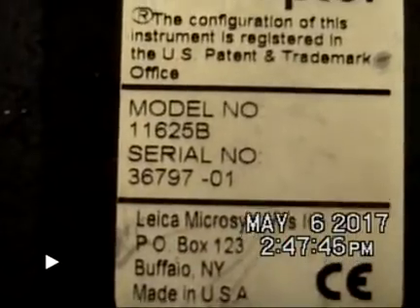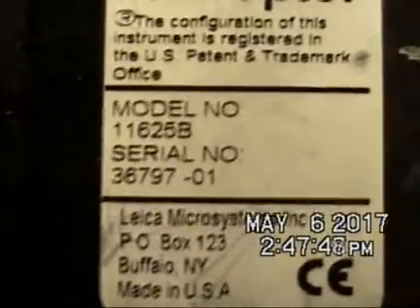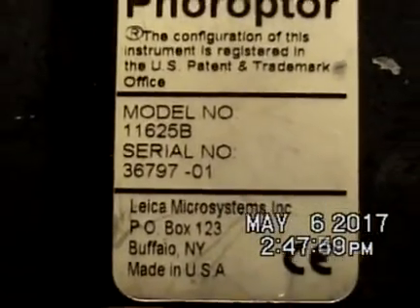This phoropter originally came from Penderbrook, then West End, then ended up at Largo apparently. It ended up in Honduras, and then ended up being dropped.